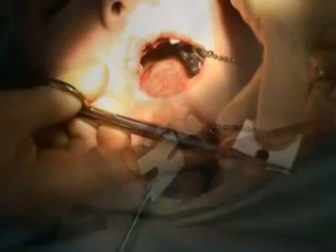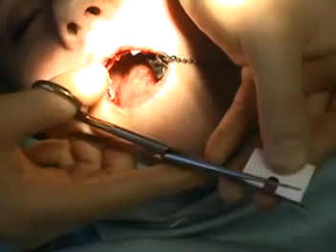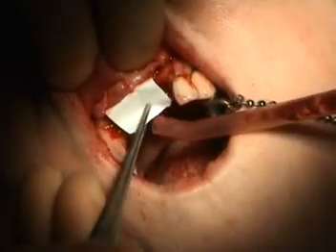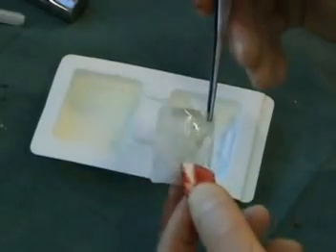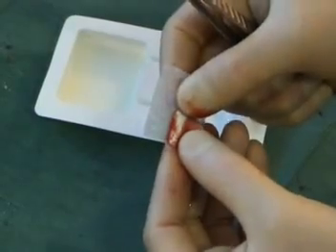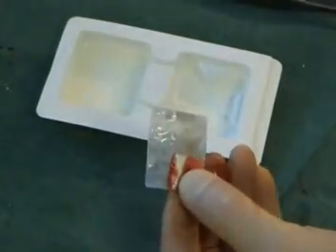A template is shaped to an appropriate size to provide guidance for the surgeon to subsequently prepare the membrane. Using the template, the prepared membrane can now be accurately trimmed to a suitable size to cover the bone defect.